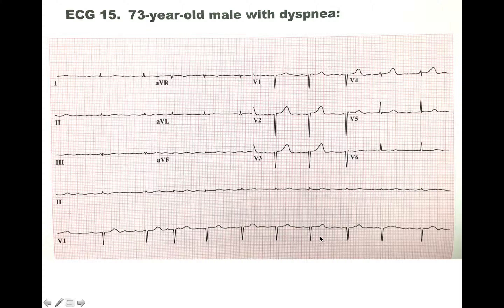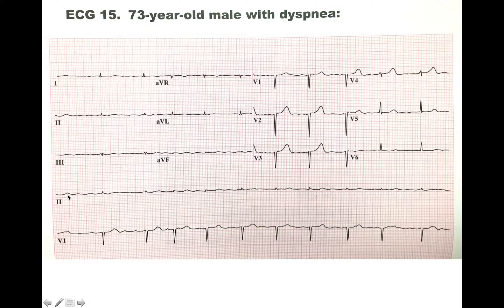Hi, this is Julia, third-year medical student. Let's take a look at this EKG. The first thing I notice is we will be counting the rate. Because it's very irregular, we are going to be using the rhythm strip rule. This is a 10-second rhythm strip, so if we just count the number of peaks: 1, 2, 3, 4, 5, 6, 7, 8, 9, 10, 11.